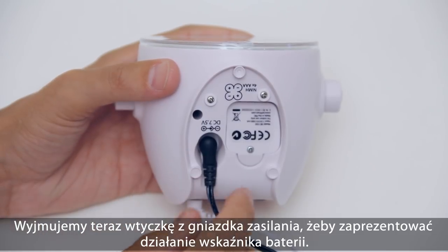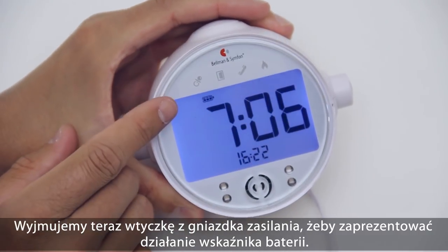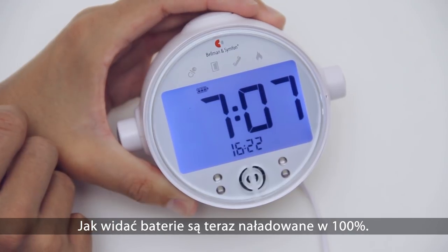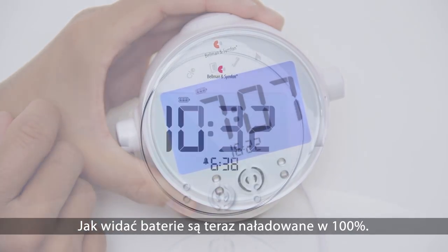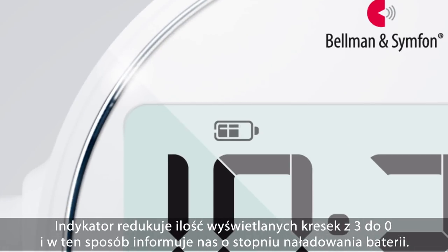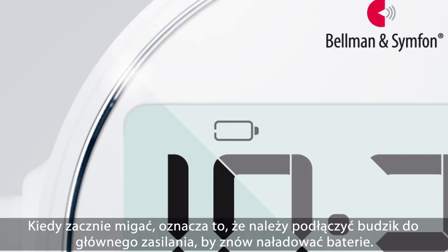Now let's remove the power cable to show the battery backup indicator, which lights up when running on batteries. As you can see, the batteries are now fully charged. The battery indicator will go from three bars to none to show the status. When it starts to blink, you need to connect the clock to mains power again to recharge the batteries.